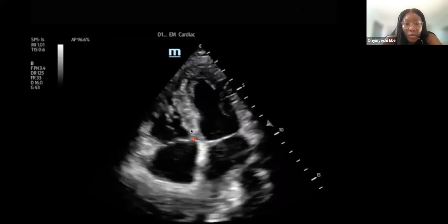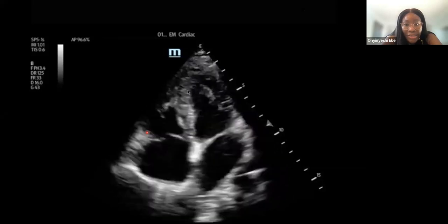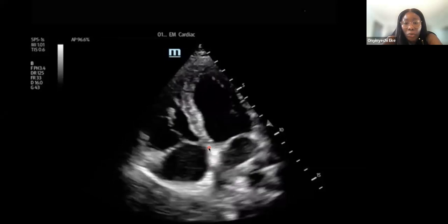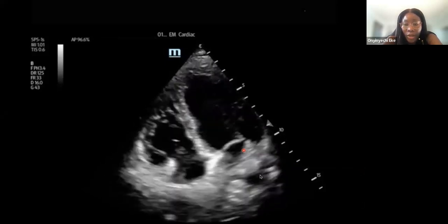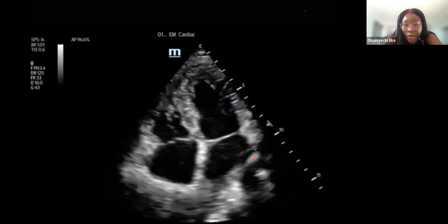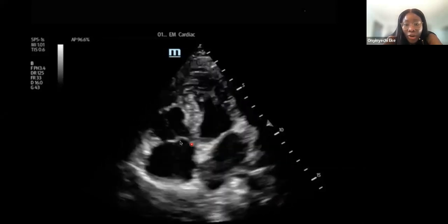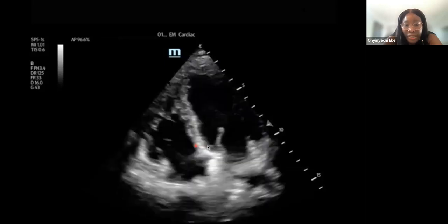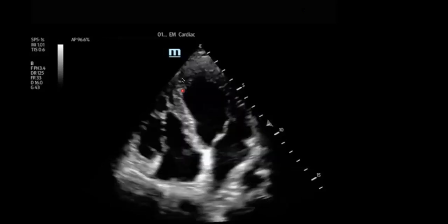Of course. So this is, again, the septum. This is the right side of the heart. This is the left side of the heart. So the way to differentiate, let me just move this here, sorry. We have the descending aorta, which is going to be beside the left heart, right? This is the mitral valve. No, I'm sorry, this is the tricuspid valve. On the right side, the tricuspid valve is more apically displaced. Look at this here. We see how it's more towards the apex.